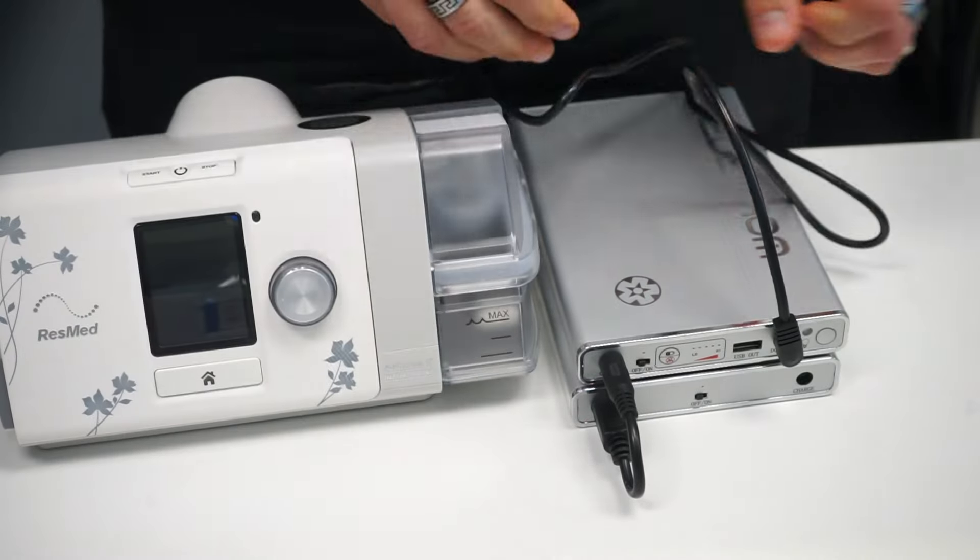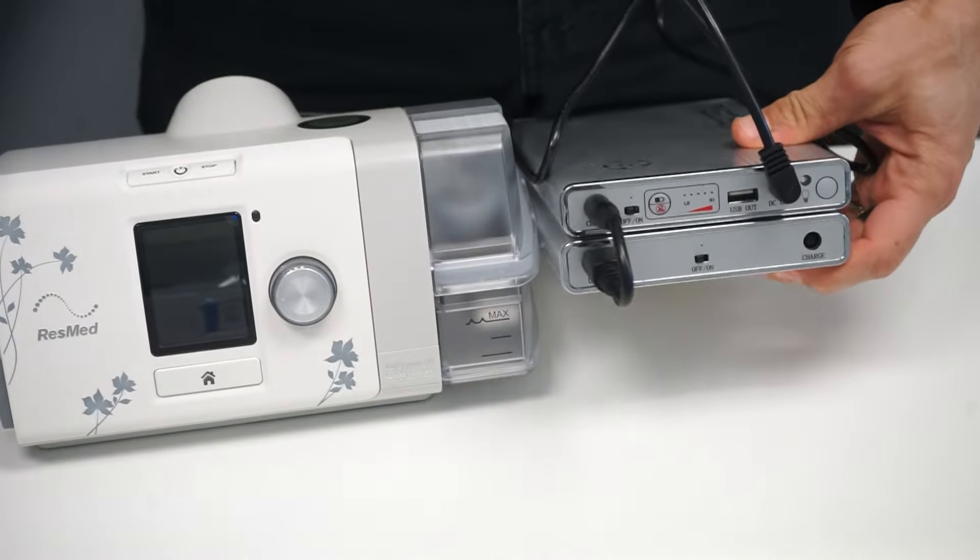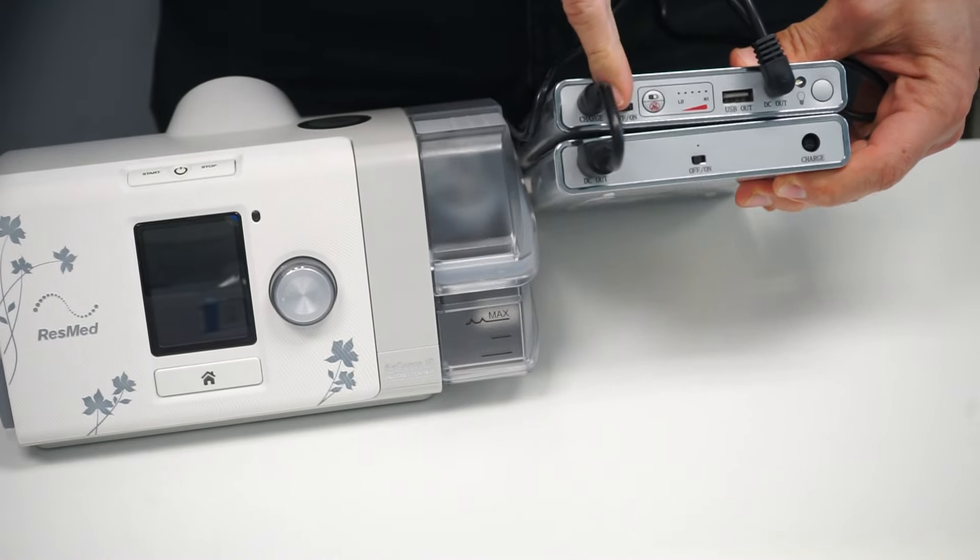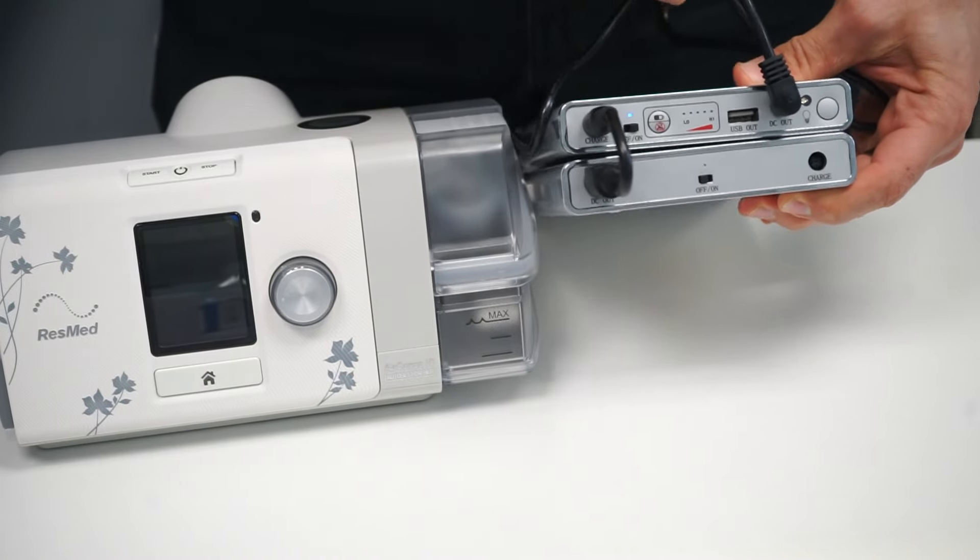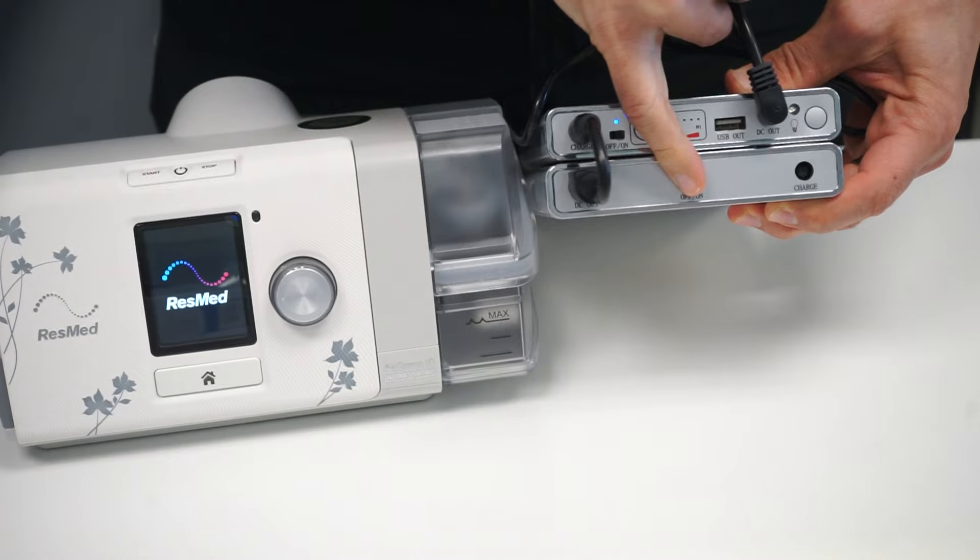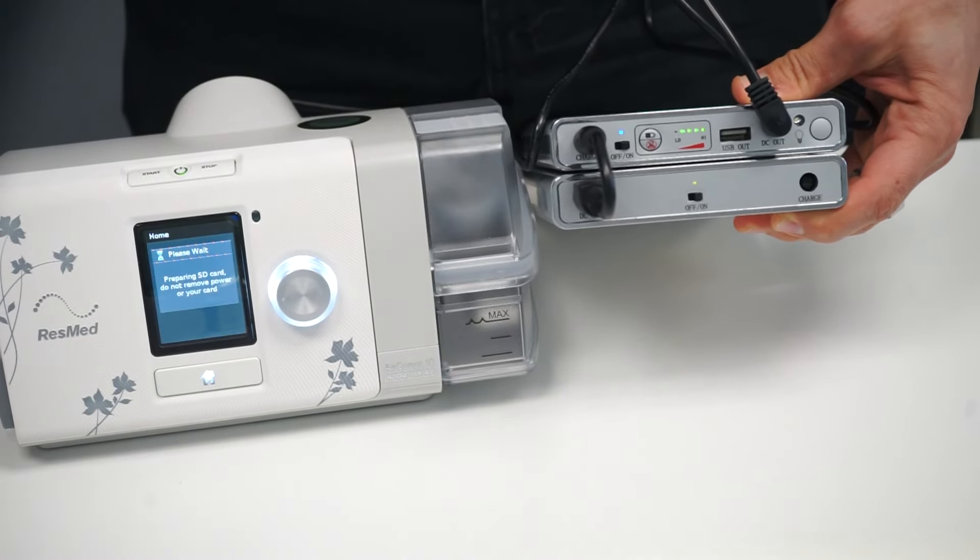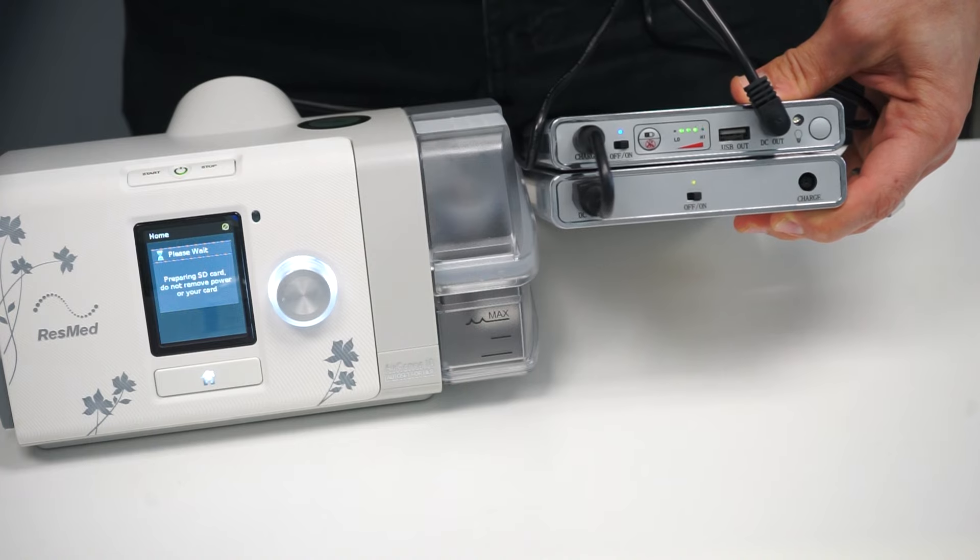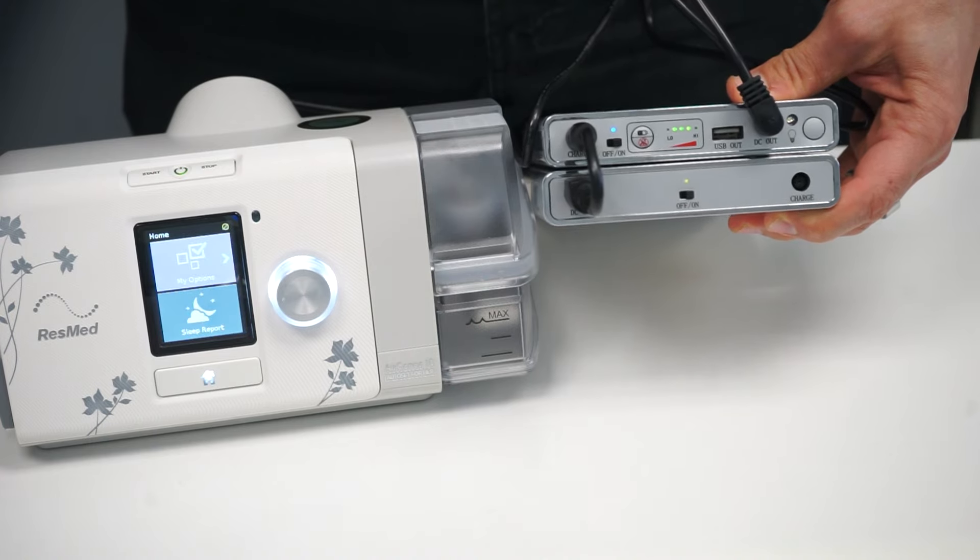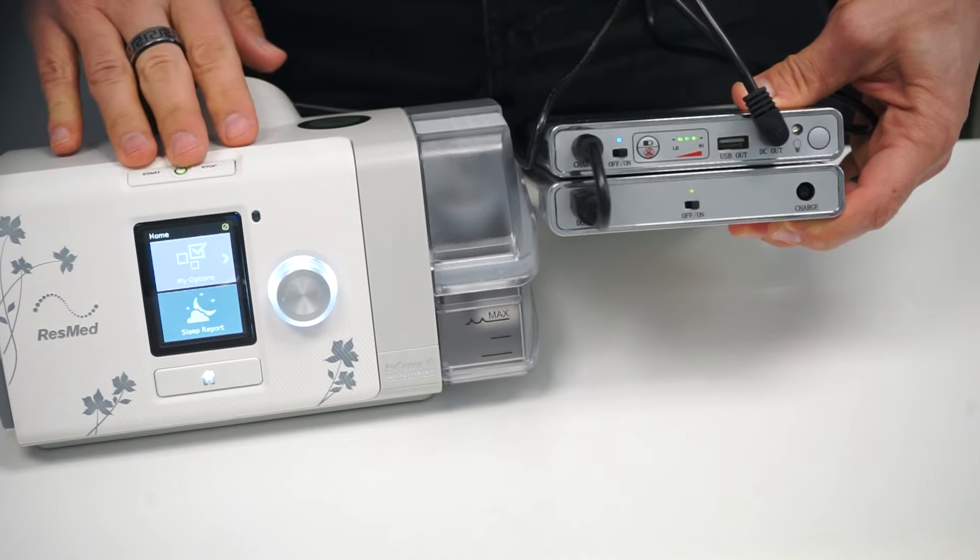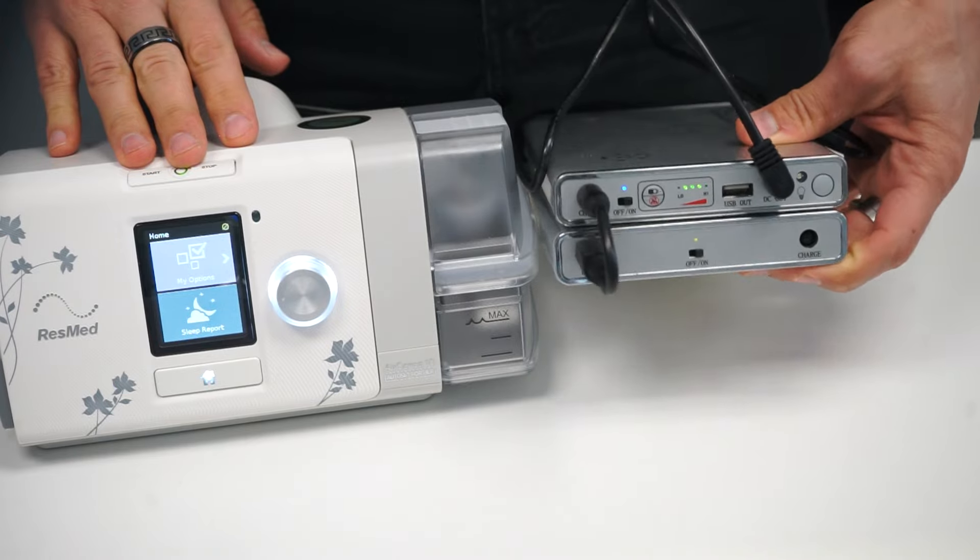In order to power the AirSense 10 up, you have to turn on the Co-Pilot Plus and your Co-Pilot 24. After both are charged, they will give you close to 20 hours of therapy from your AirSense 10 device.